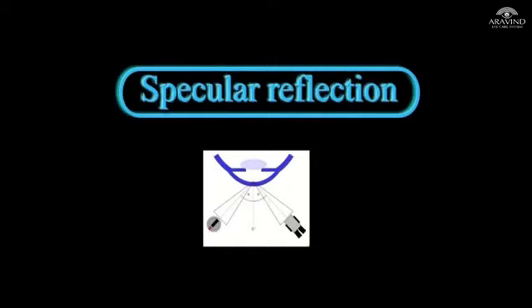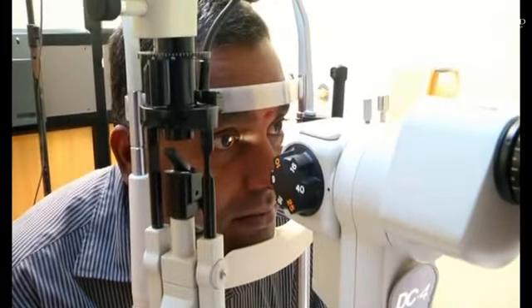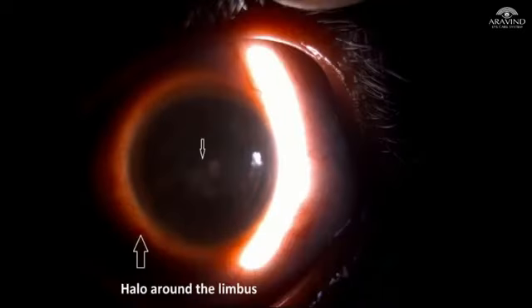Moving on to the specular reflection, magnification and moderate broad beam is used to examine the anterior surface like the precorneal tear film, and with higher magnification, endothelial guttae can be appreciated. Proceeding to sclerotic scatter, in which a narrow vertical slit is directed in line with the nasal limbus.